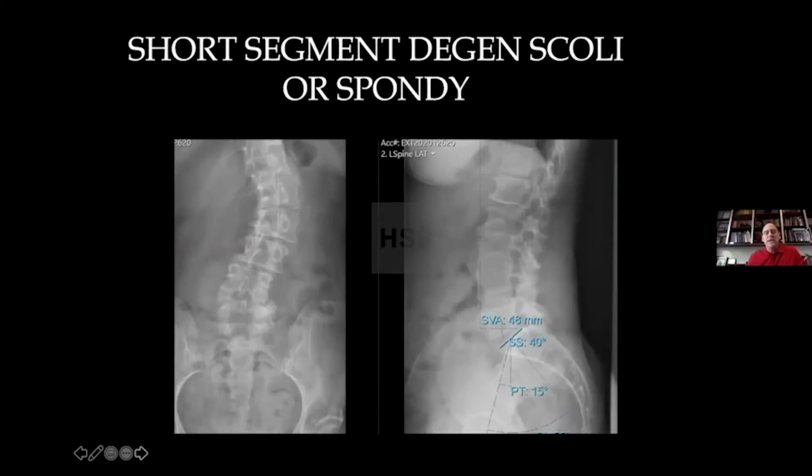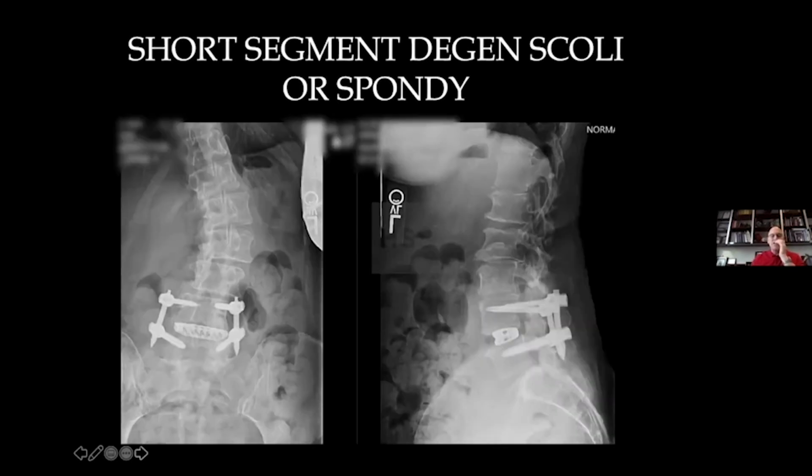So here was a lady who came from Florida. She had a horrific L4 radiculopathy, failed everything. And this lady, you'll see the long films in the post-op, but she would have gotten, in my hands, a much bigger procedure than she would have gotten with this. We passed it around the service. People said, if you really are convinced that she only has her exiting root at 4-5 there, do just that level, and maybe she'll need something later, maybe not. But so we did this patient with a single position, lateral, robotic.